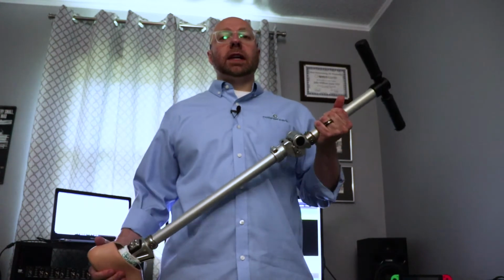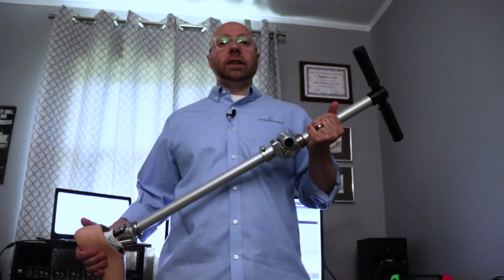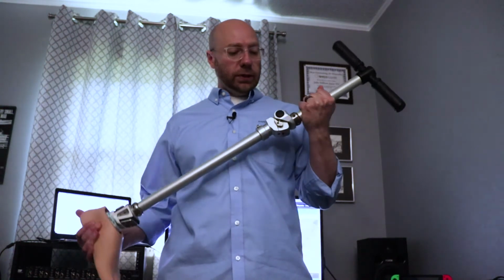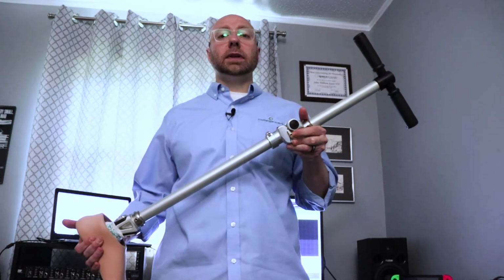Hey everybody, I'm John Szasz, the technical service guy over at College Park. I've got our Guardian knee here, and I wanted to show you a few things. The first thing I wanted to show you is turning on and off the manual locking mode.